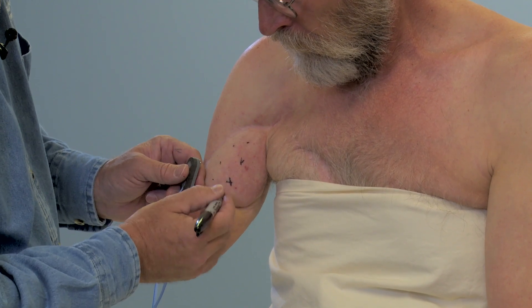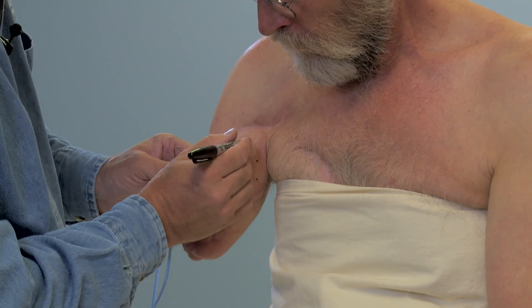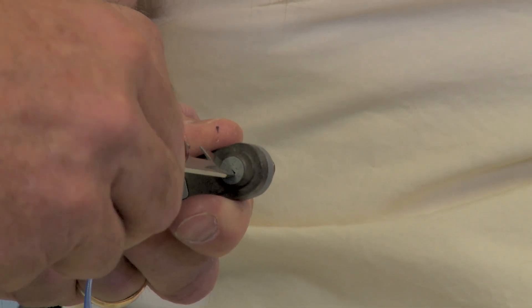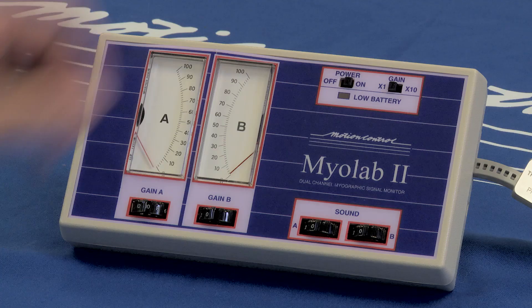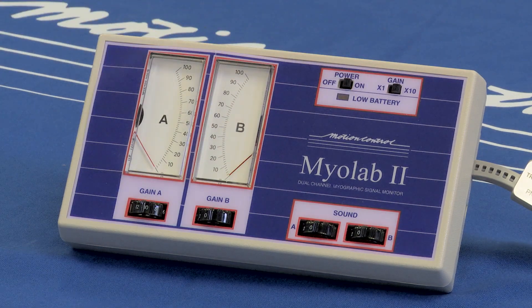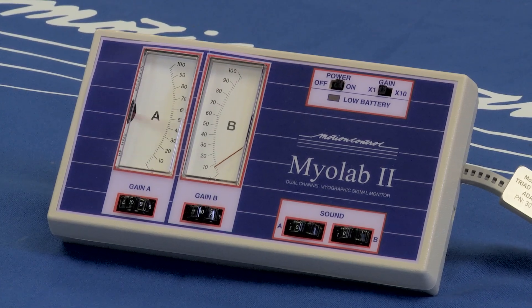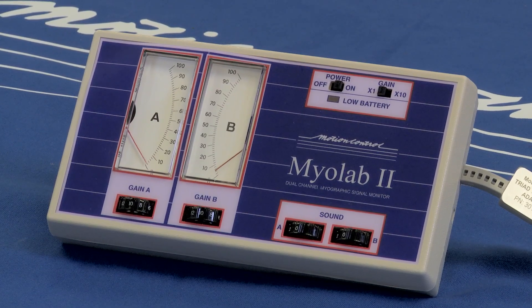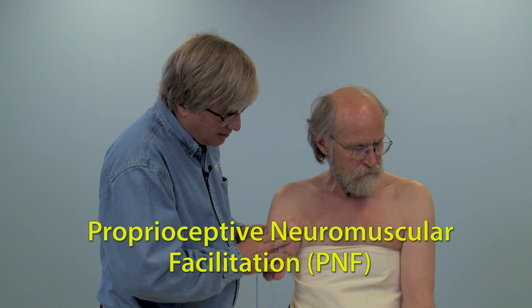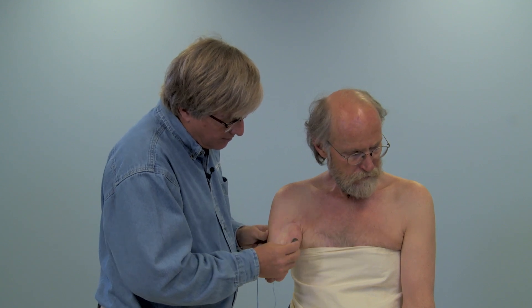If possible, mark more than one site within the area of strongest signal. If the muscle is too weak to register, set the electrode preamp gain to 5. If the signal is still too low, set the Myolab gain to the x10 setting. If the patient's signals are weak or there is significant co-contraction, occupational therapy is very helpful for proprioceptive neuromuscular facilitation, or PNF, and EMG training. Information regarding PNF training can be obtained by contacting Motion Control.